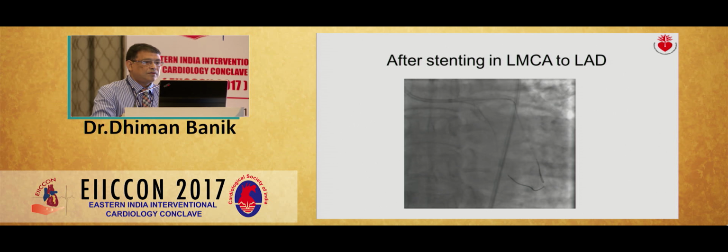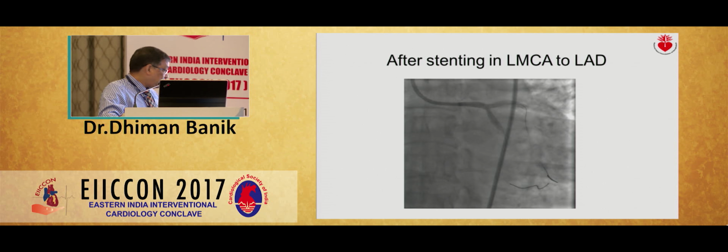You didn't post dilate because there was an undilated portion in the distal portion of the stent? Yes, I did it.